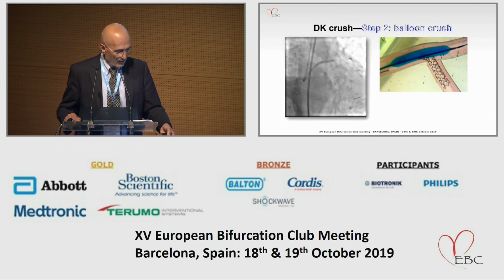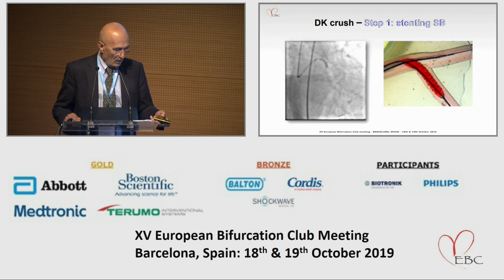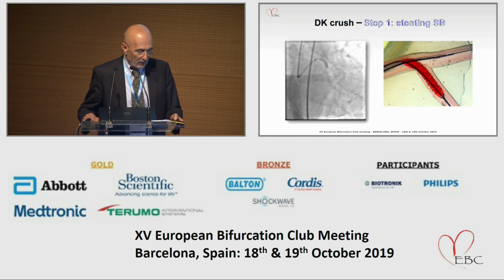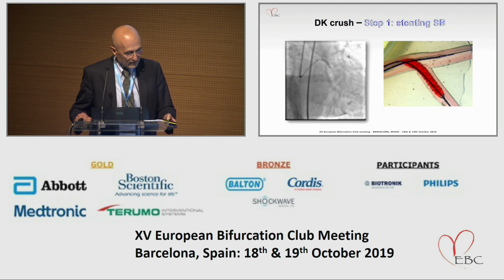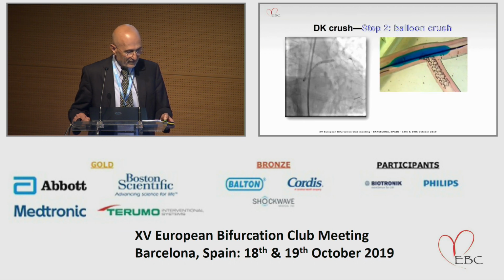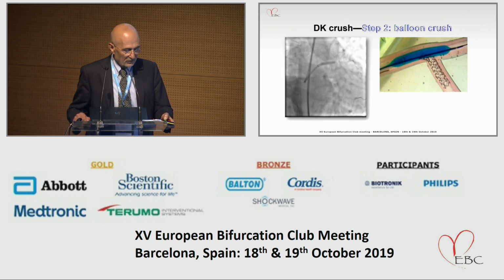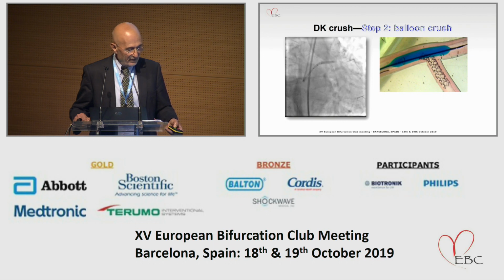And this is the first step: implanting the stent in the circumflex with the simultaneous balloon in the LAD. After stent deployment, the second step is to crush the stent with the balloon already positioned in the crossover left main LAD.